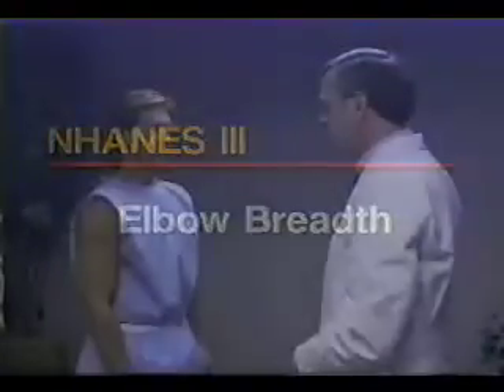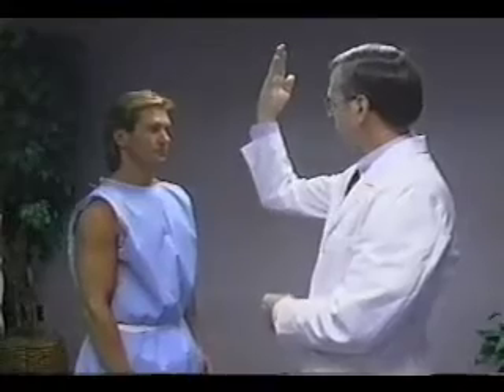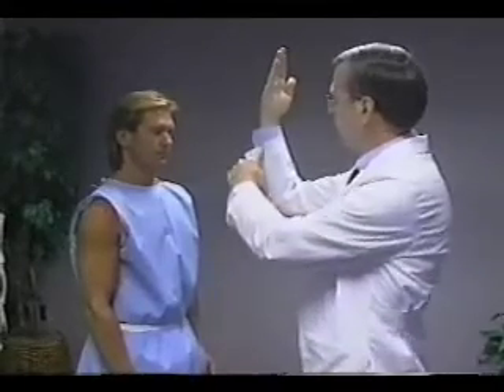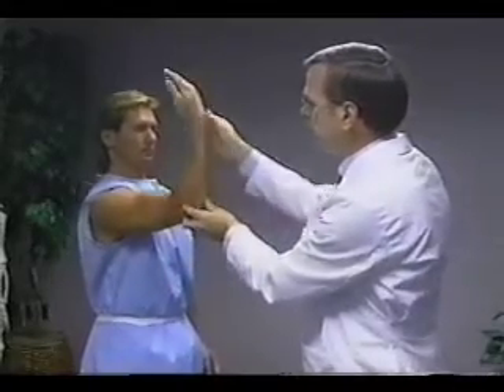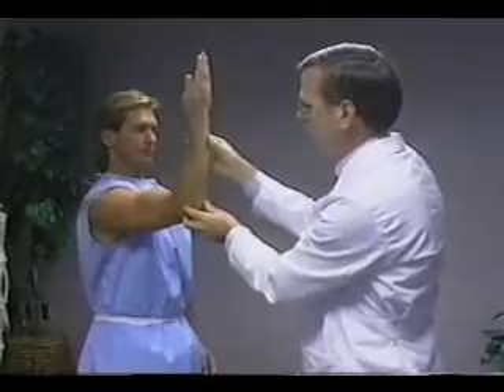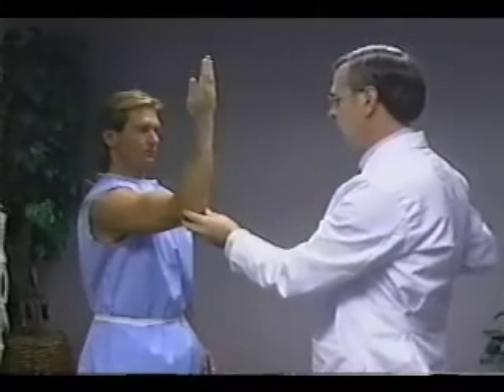For elbow breadth, the subject stands facing the technician. The right arm is extended forward and is flexed so the upper arm and forearm form a 90-degree angle at the elbow. The fingers point up with the posterior part of the wrist toward the technician.